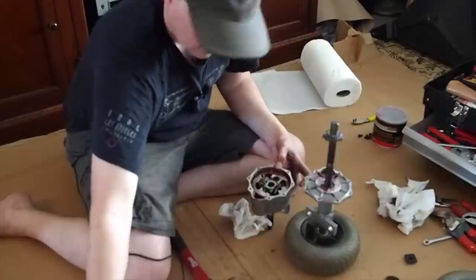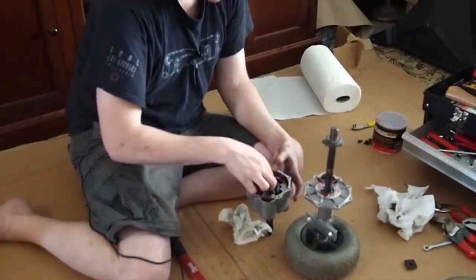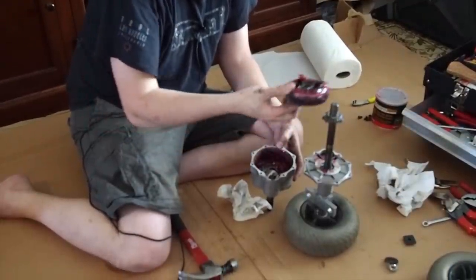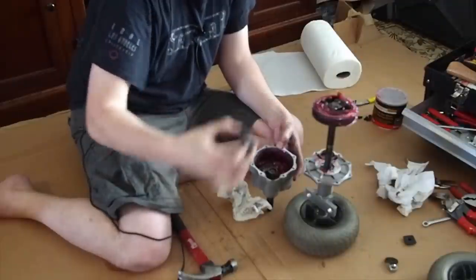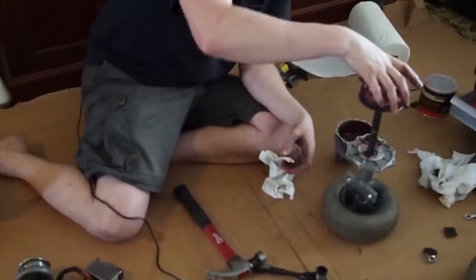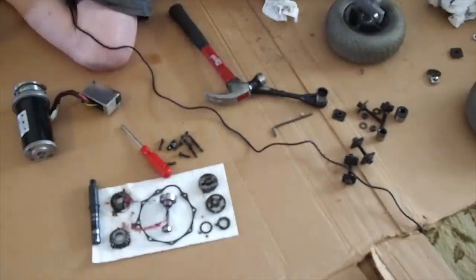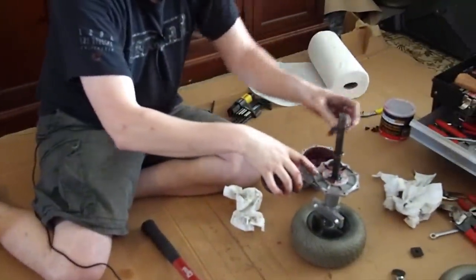Okay, here's a paper washer. It's got a little plug there too. Keep that all together. I want to take this thing apart. All right, so I'm not doing a very good job of keeping everything together. This thing ends up going on here, like that. And then there are these gears. I'll put this on this paper towel as well. I have this gear and that washer. I'm going to remember that one goes on the wheel side. Here is this washer. I'm going to take this pin out.